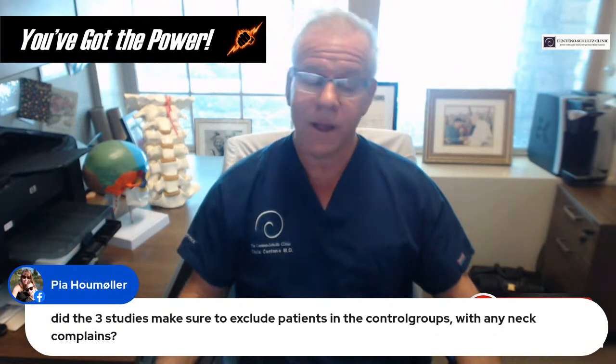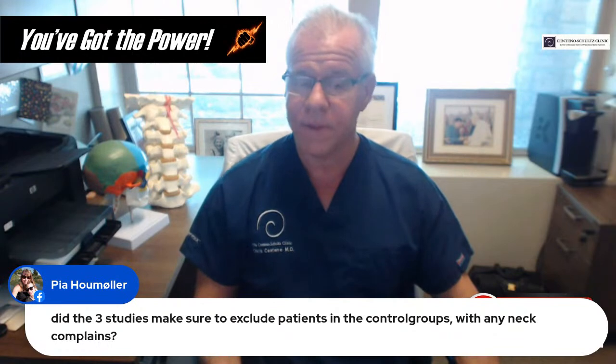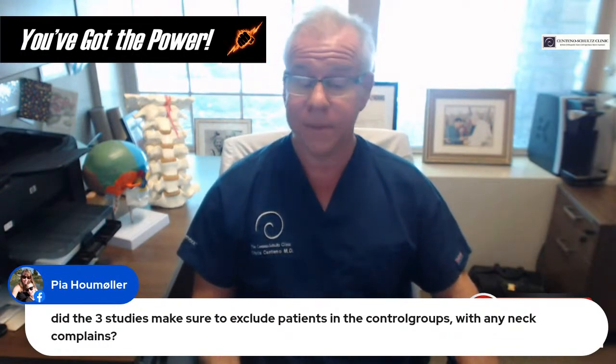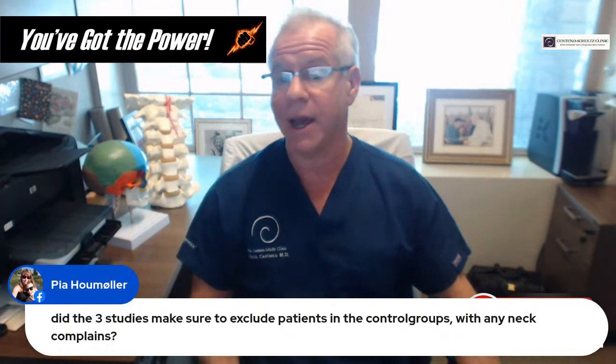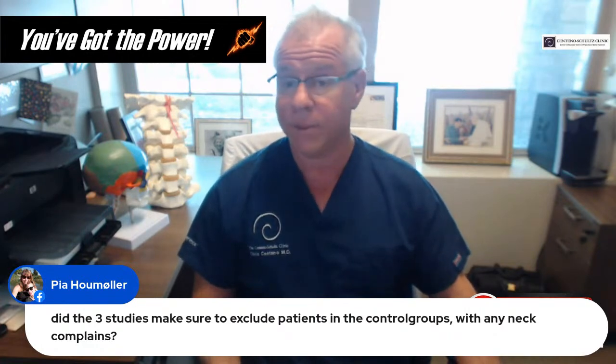Yeah, Pia, that's a good question. I'll have to look back at the studies, but I think the problem you're bringing up is a good one, and that is what percentage of patients who just had neck complaints would have CCI. That would be a very small number anyway. We're talking less than 1%.